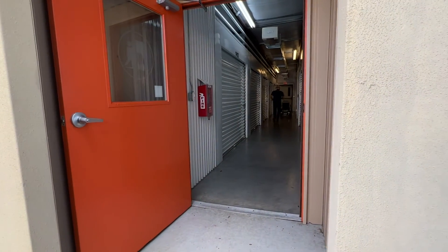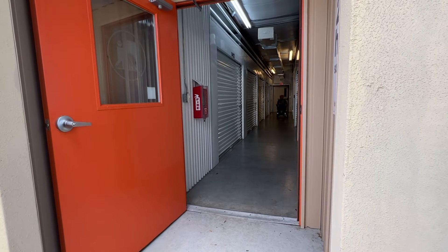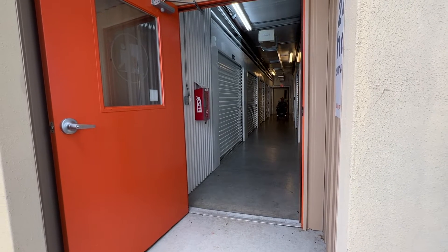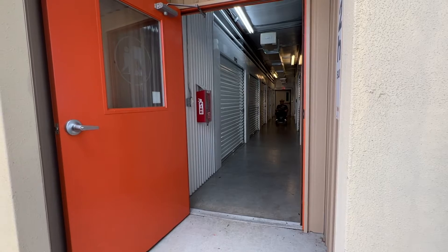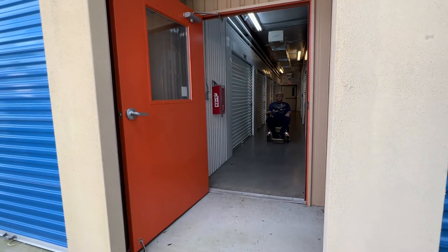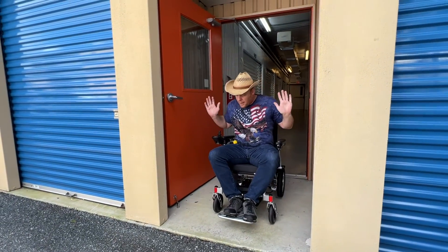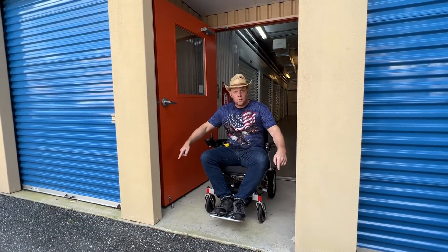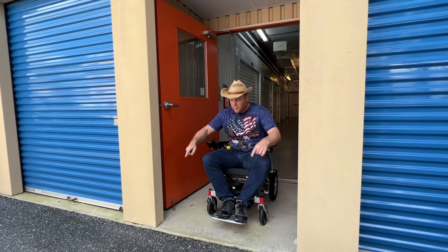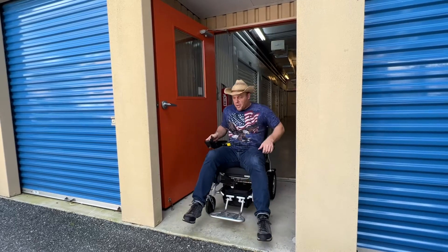I'm going to get out of breath doing all this sprinting down the hall. The Electra 7 — here we go. Got some good momentum going. Cut. To be fair, I had a little bit more momentum, but it took about five feet from full tilt for this chair to stop.